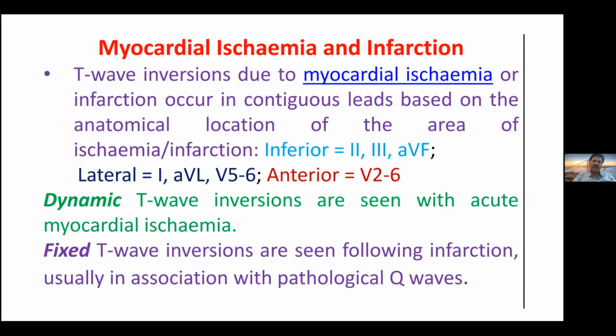And this is most of the time benign, nothing is happening. And ischemic T, I told you about, it can happen anywhere based on the ischemic zone. It corresponds to the area of ischemia. And usually there is a symmetrical T wave inversion. Whenever there is a pain, there is inversion and it can revert. The dynamic T inversions are also very, very important in diagnosing the ischemia. That is the reason why we always ask for serial ECGs to assess the dynamicity of the STT changes.